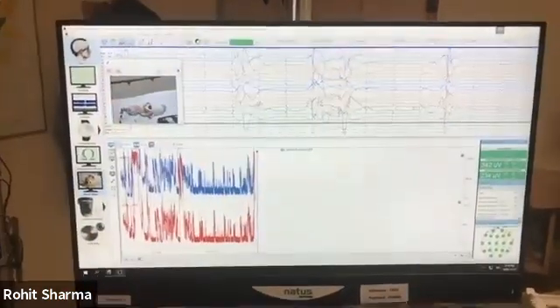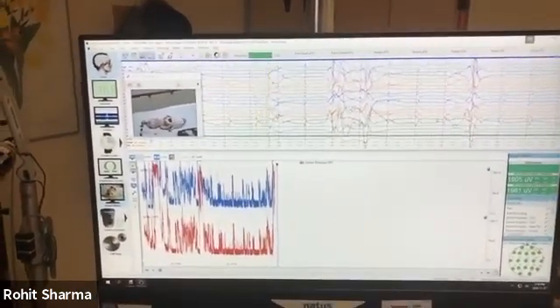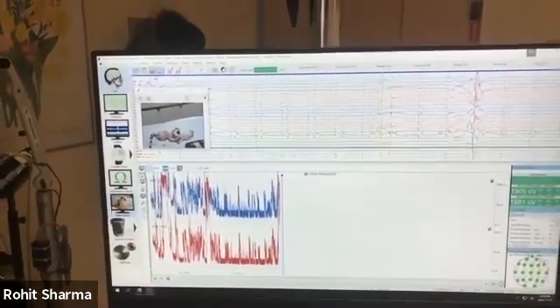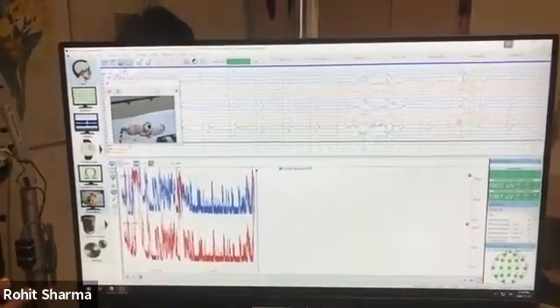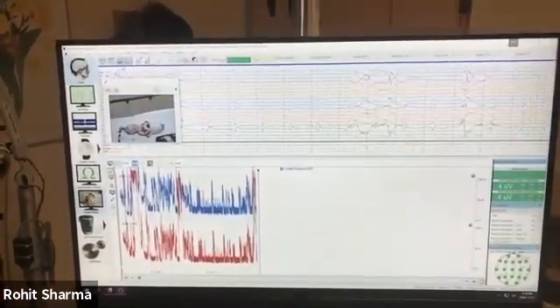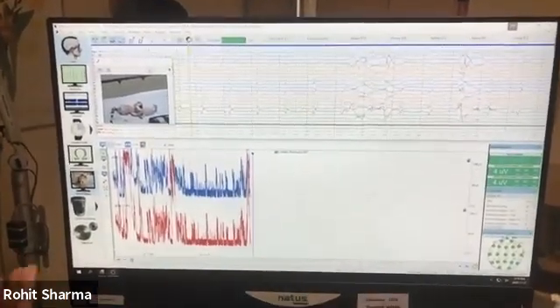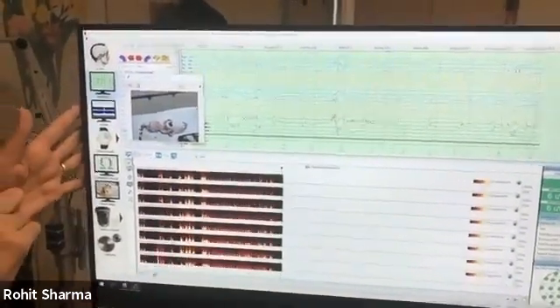The top part will show the EEG and the bottom part will show the amplitude integrated EEG. In this case, we have the CFM. It is a real touch screen, so if you do anything to the screen, it'll do stuff. If you want to review the EEG, for something that's happened in the past, you just go to the button here that says review.